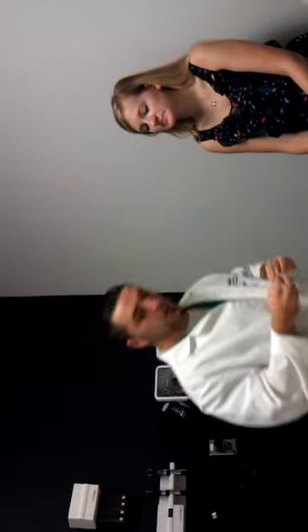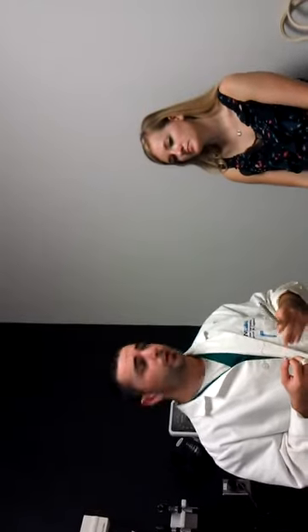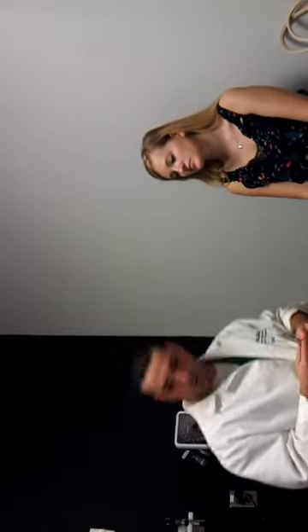Okay, the bone conduction was 7 seconds and air conduction was 21 seconds. We conclude that this is a ratio of 3 to 1. Normal finding, passing rate is 2 to 1, so the patient's right ear is intact. This is bilaterally assessed, so I would go ahead and do this on the other side as well. Okay, the Rinne test has been assessed for bone conduction and air conduction.